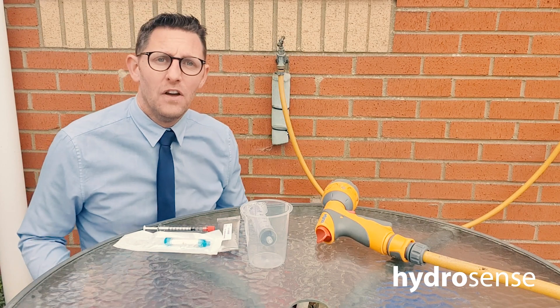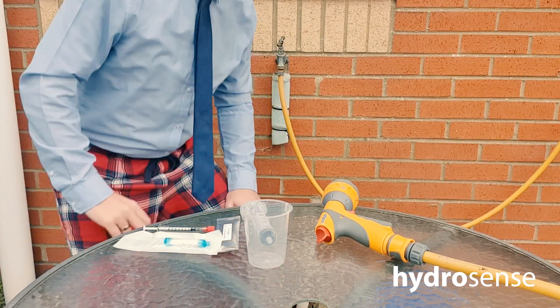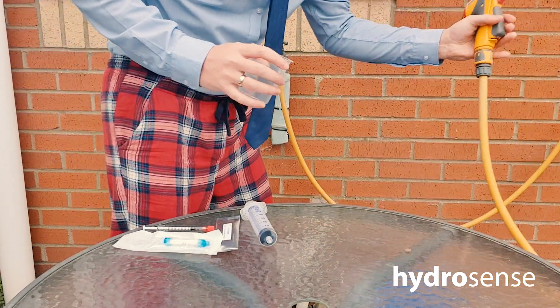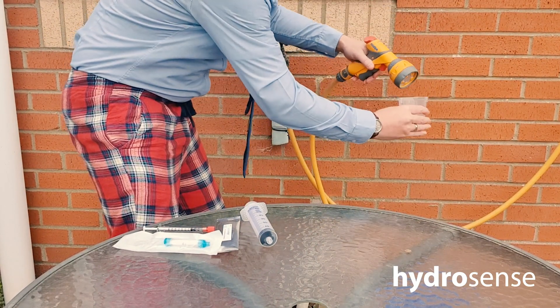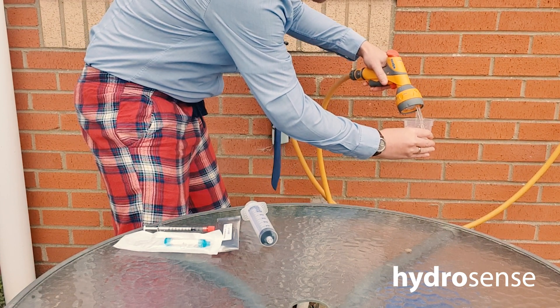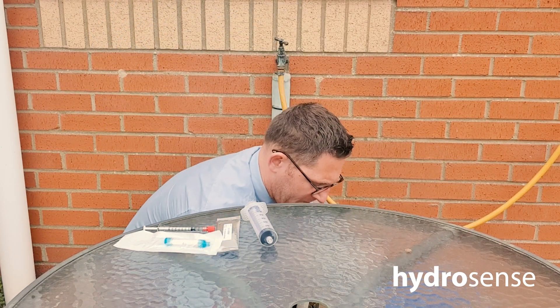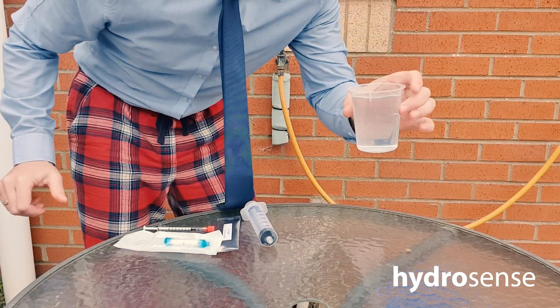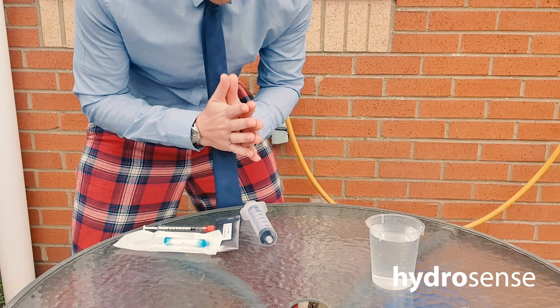What we're going to do is test my garden hose, which is linked up to my outside tap. The first stage — the most important thing — is to take the sample. We fill up the beaker to 250ml with water. There we go — 250ml sample water.